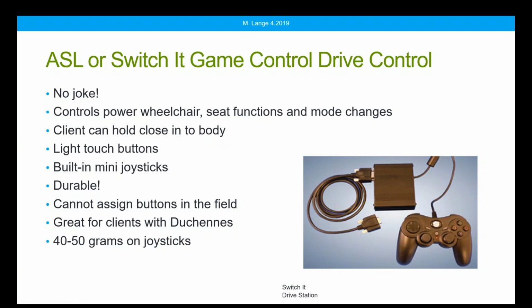This method works really nicely for clients who have Duchenne muscular dystrophy because those clients will start having more and more difficulty using a standard joystick as their muscle weakness progresses.